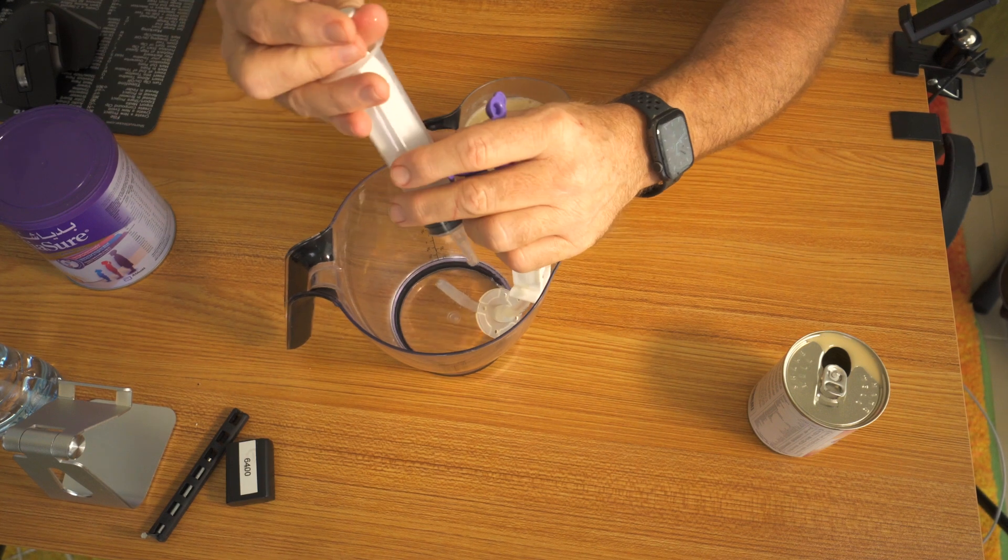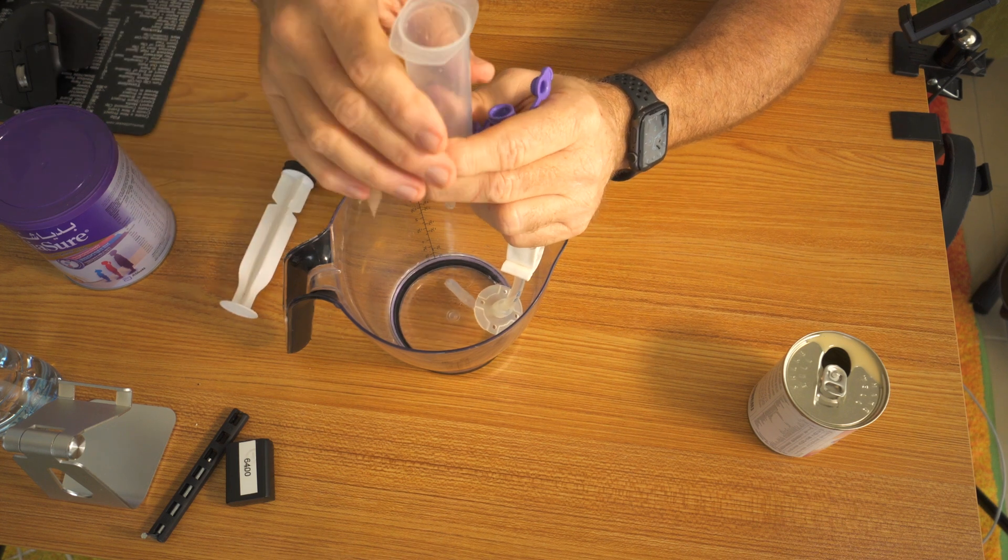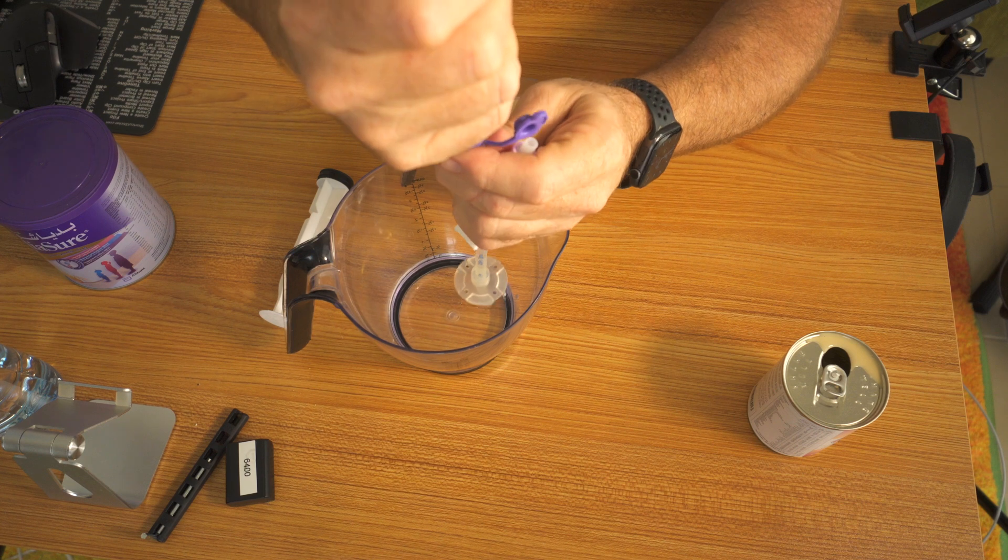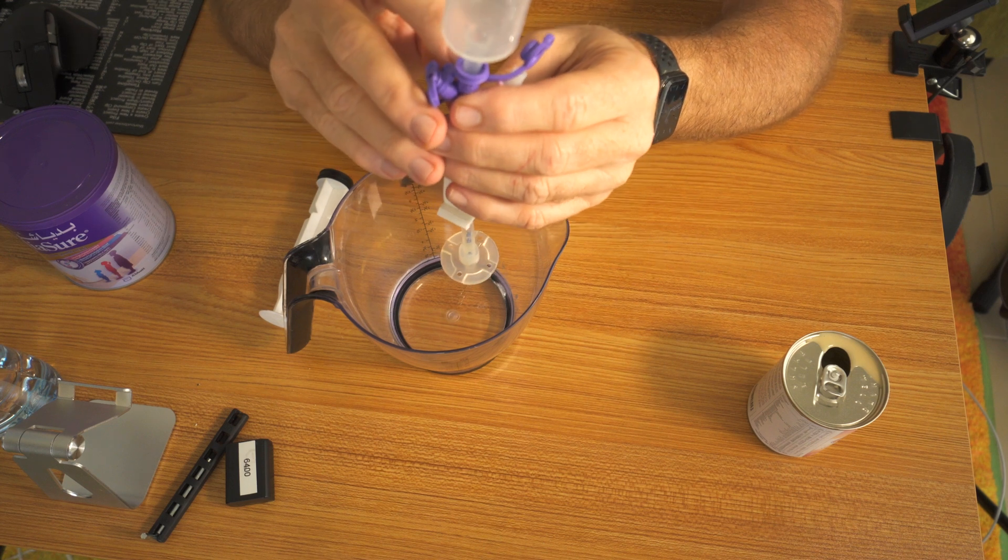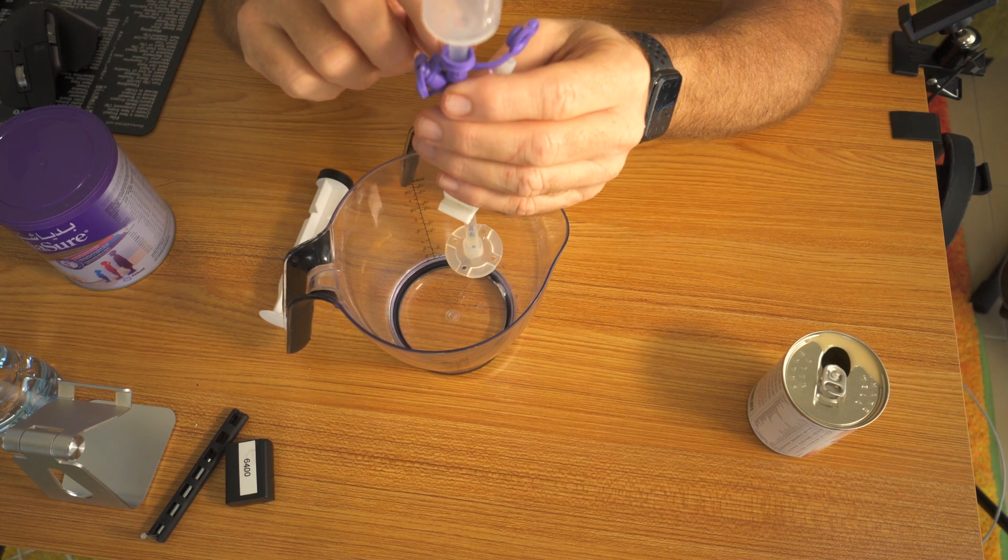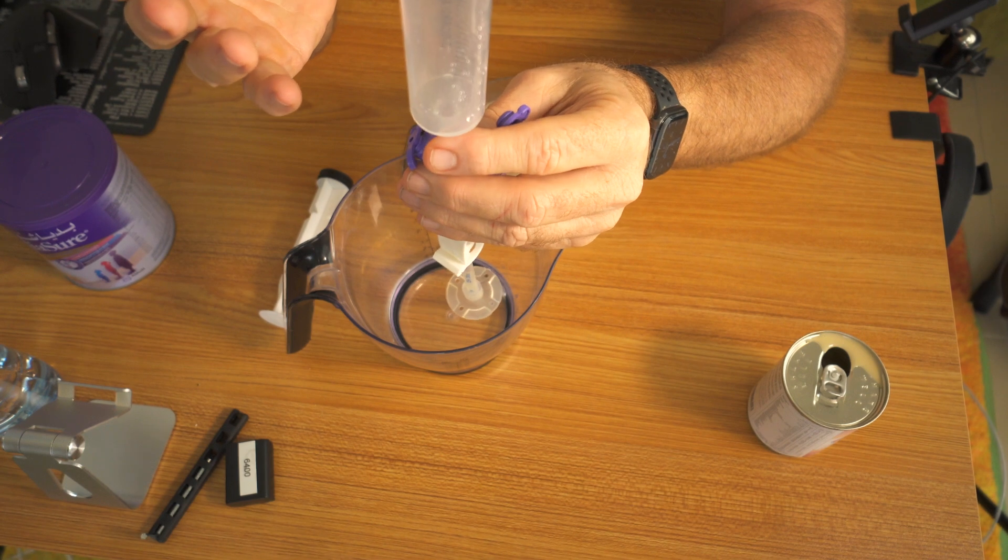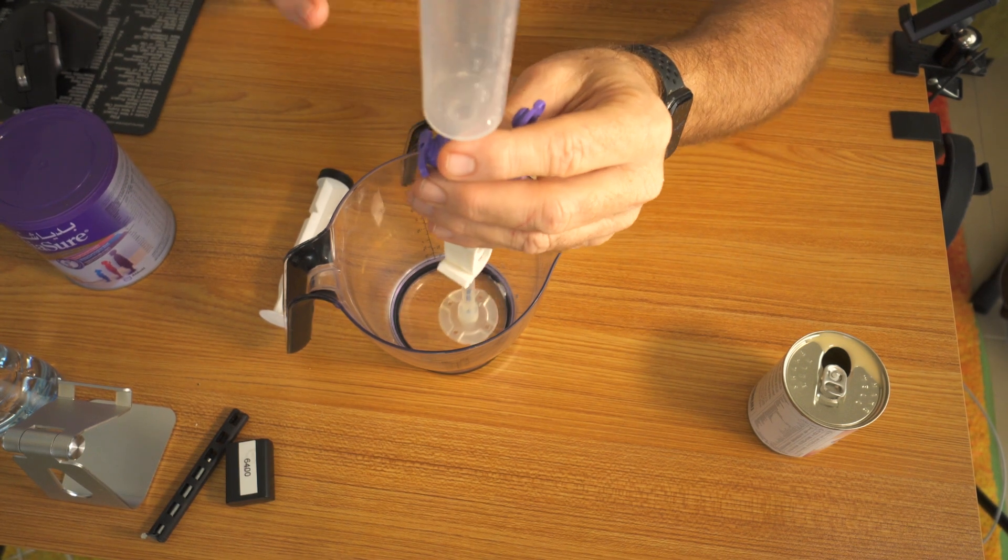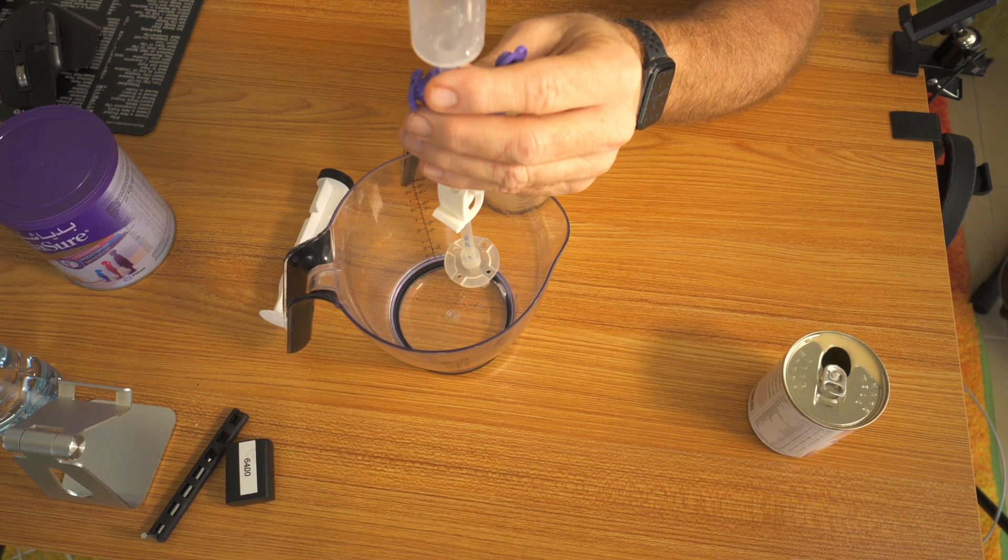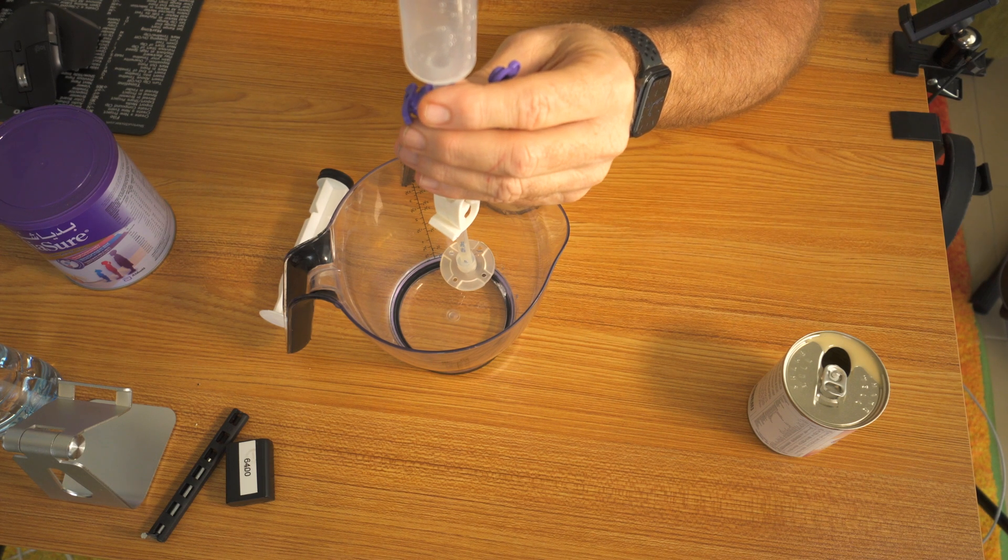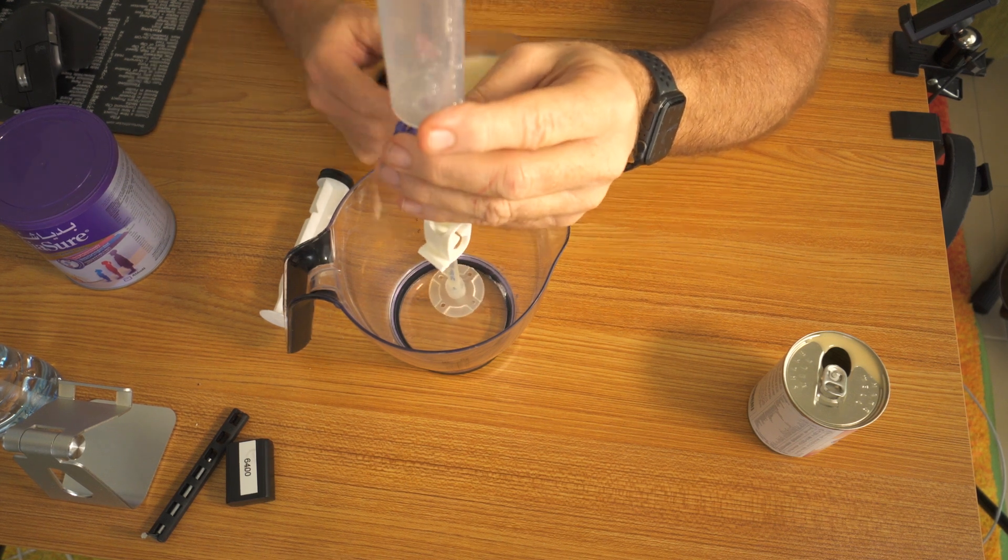One thing you can do is take the plunger out of your syringe, insert the syringe back into the feed port. This is key. Make sure you get this thing in there tight because this will swell over time and get stretched out. There is nothing worse than pouring whatever you're drinking through this tube and having it pop loose and it going all over the place. Because you can't stop it, it just flows right out and you've got Glucerna all over the table, all over the couch, all over your clothes. It's aggravating, makes you pretty angry.